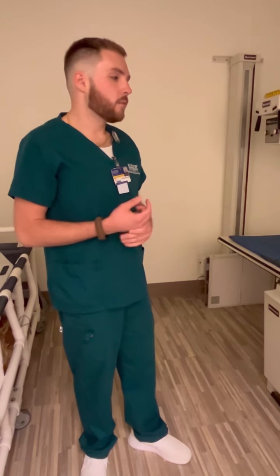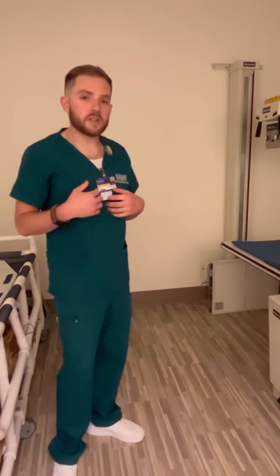And once you get all of the information from the patient that you think you need, just repeat it back to the patient so you make sure everything you have is accurate for the radiologist to read through. And once you do that, that's when you would ask your patient to change any clothes other than shoes or socks, anything like that's fine. But clothes have to come off.